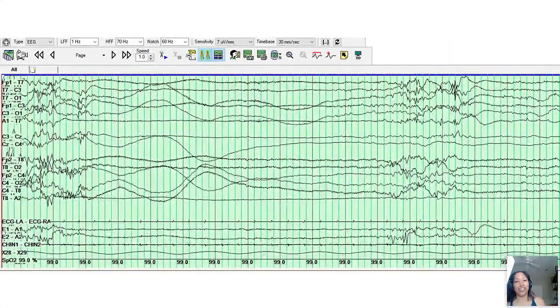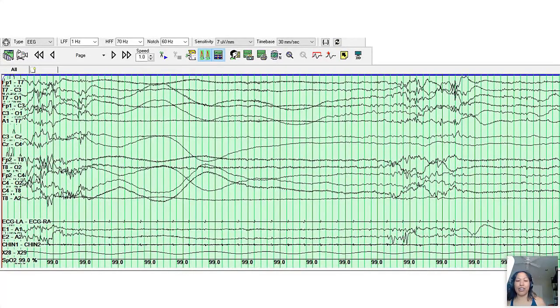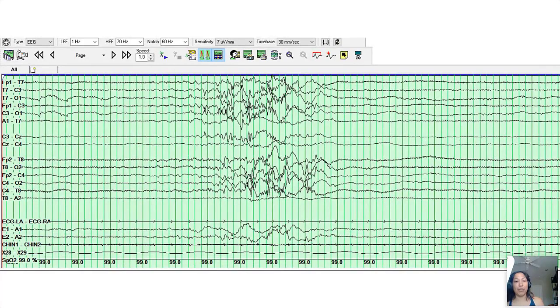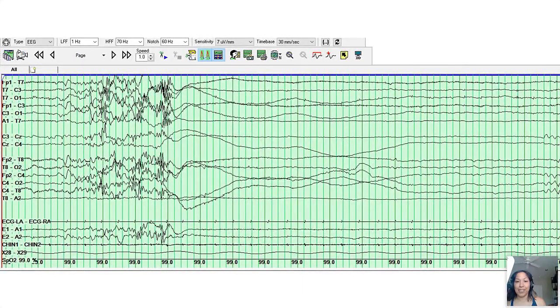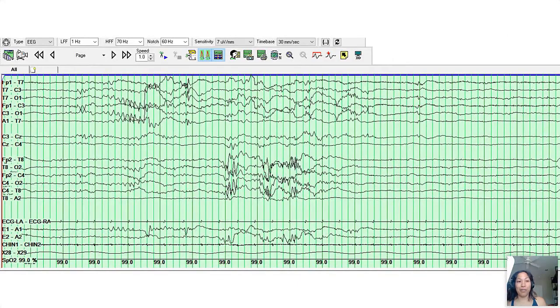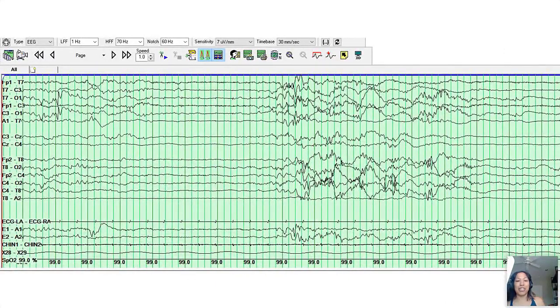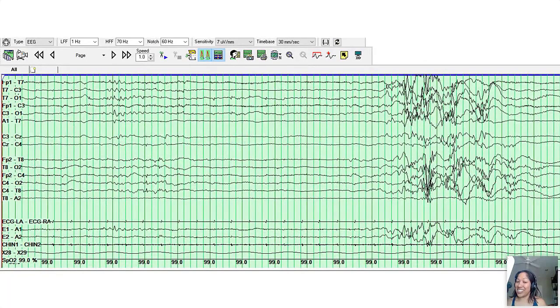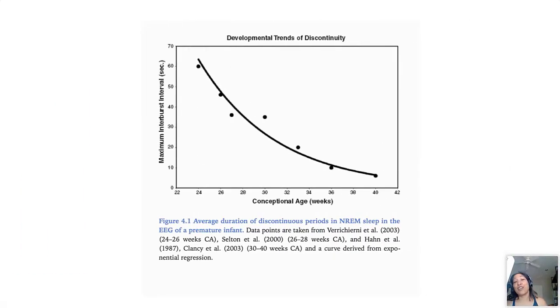And here's a bit of a longer period of discontinuity, and yeah, this is also hanging out right around nine, nine to ten seconds of discontinuity in between these bursts of polyfrequency activity. So I just kind of wanted to go through a few pages of this so we could see what a baby is sleeping, neonatal EEG can look like.